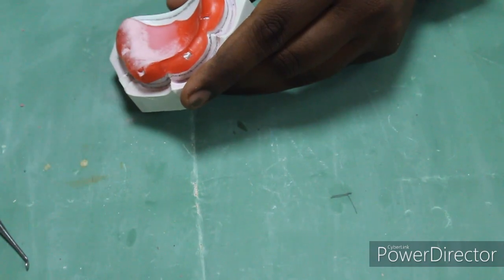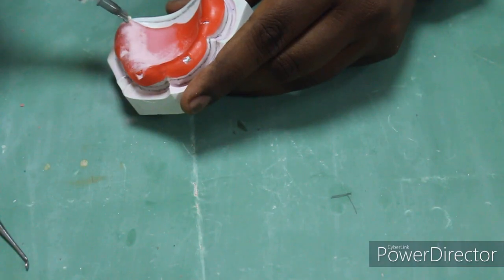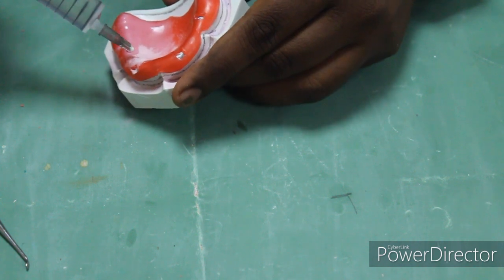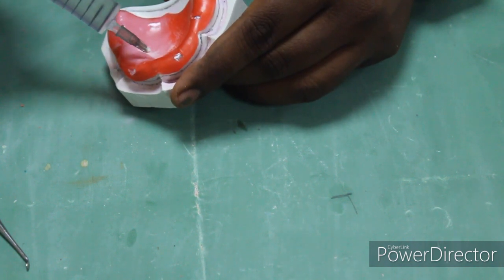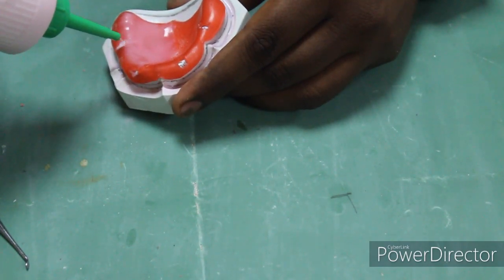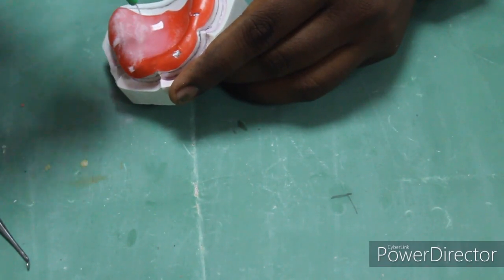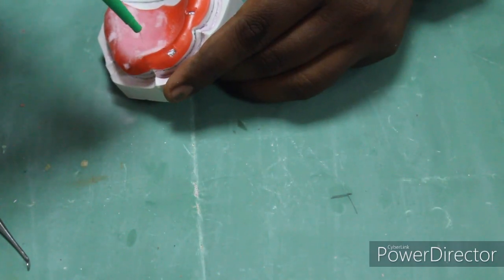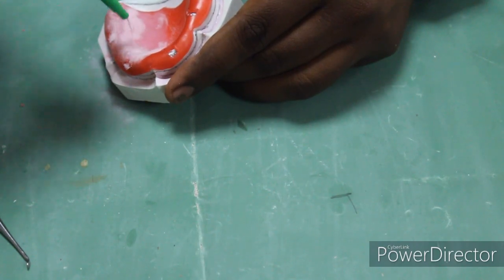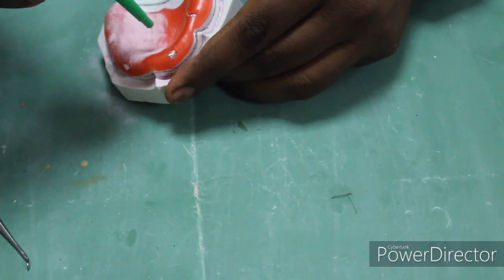So while adding on the stopper region, you have to make sure that it flows properly into the stopper region. Why? Because if there is any chance of air bubble entrapment in that region, it will cause voids in the stopper. So the purpose of the stopper will not be fulfilled. I am adding on an incremental basis. So to control the thickness of this special tray, I am adding in increments, not in bulk.